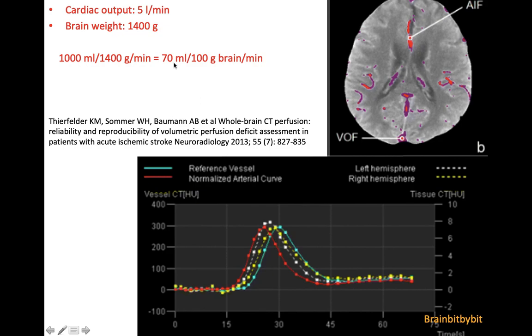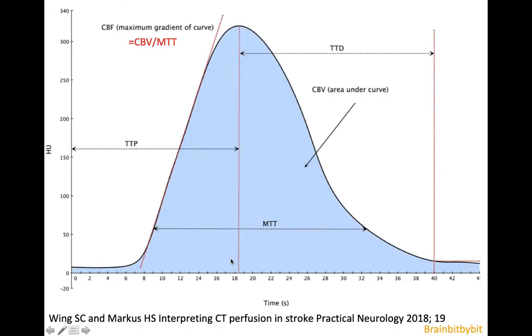You can quantify perfusion with CT, and you image at different time points after administration of contrast. You can draw a region of interest in the artery and the vein, and with this arterial input and venous output curve, you can calculate the perfusion of the brain tissue correlated to the attenuation. If you take a closer look at the curve, you can see different parameters.